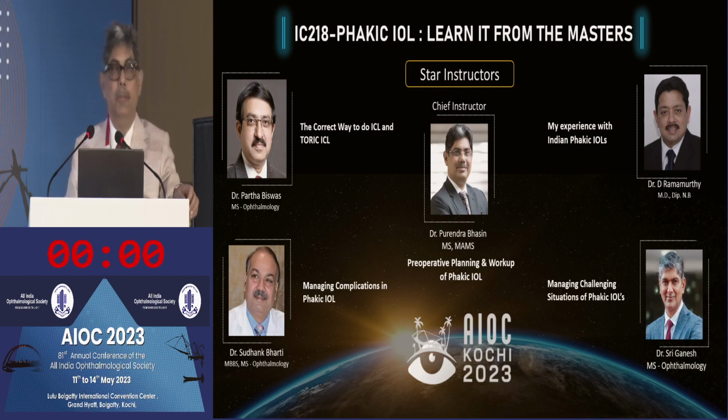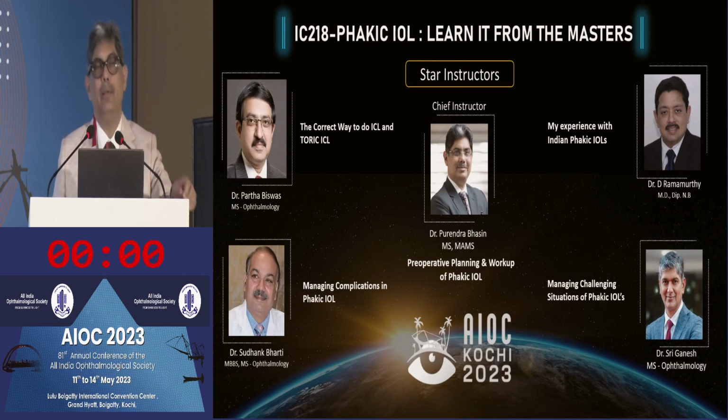So, PHAKIC IOL is in vogue, and I have been practicing this for almost 18 years. Before that, I used to use the Verisyse lens, which was an iris claw lens, and I did a good number of cases, around 30 odd iris claw lenses, but there were limitations and many issues, and we were not able to correct toricity.